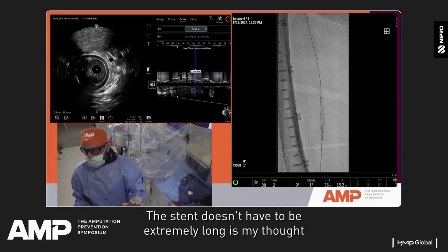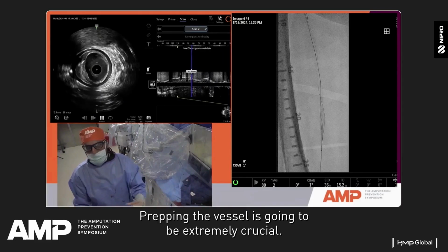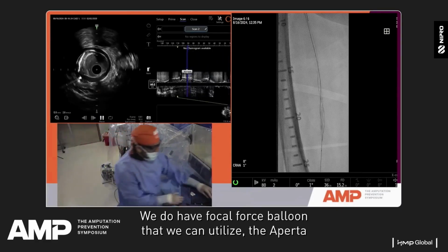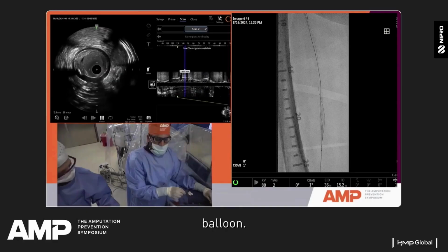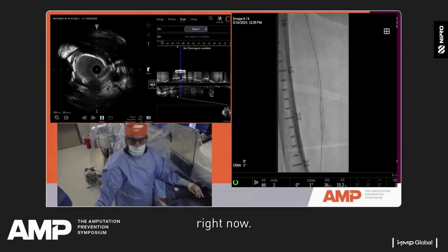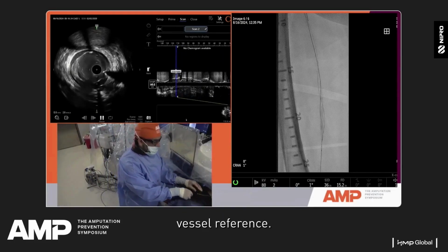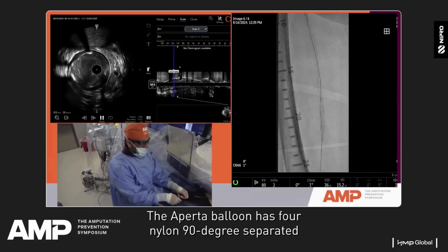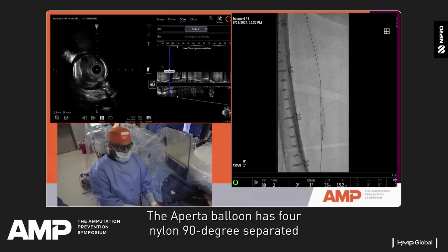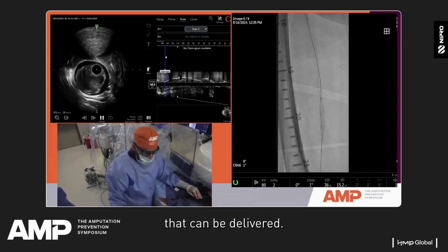The stent doesn't have to be extremely long is my thought process. Prepping the vessel is going to be extremely crucial. We do have focal force balloon that we can utilize, the Aperta balloon. We have 5 millimeters, 6 millimeters right now. I'm going to get a size for us right now based on our distal vessel reference. The Aperta balloon has 4 nylon 90-degree separated areas of focal force that can be delivered.